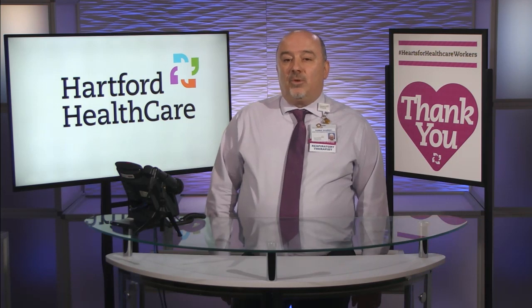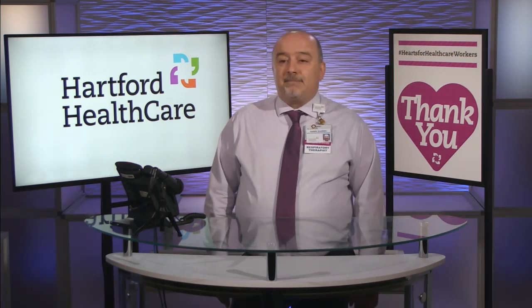The process is we're going to use one ventilator, and in case you see the video afterwards, this ventilator is split up with a dual limb tubing that's going to go to two separate patients. We do have viral filters in line that protect the patient, the workers, and the environment from inhalation and exhalation of patients' gases. Those are split in two, both inhalation and exhalation, and both patients are ventilated simultaneously. The benefit is to provide ventilatory support for more than one patient in case of an overflux of patients in our facilities that need ventilatory support.